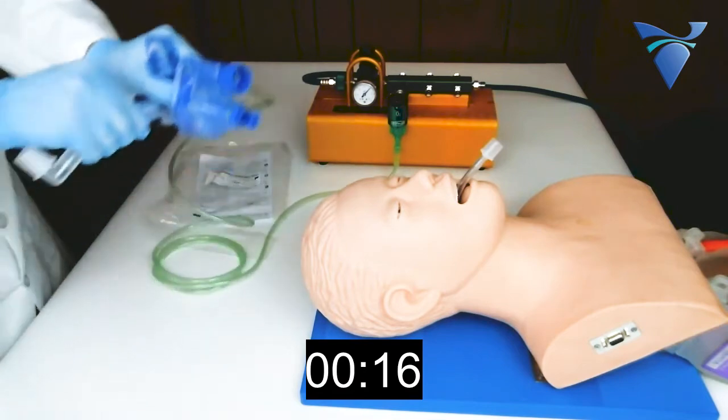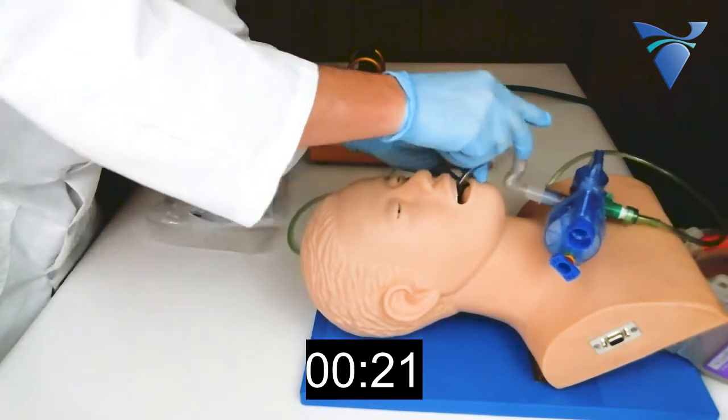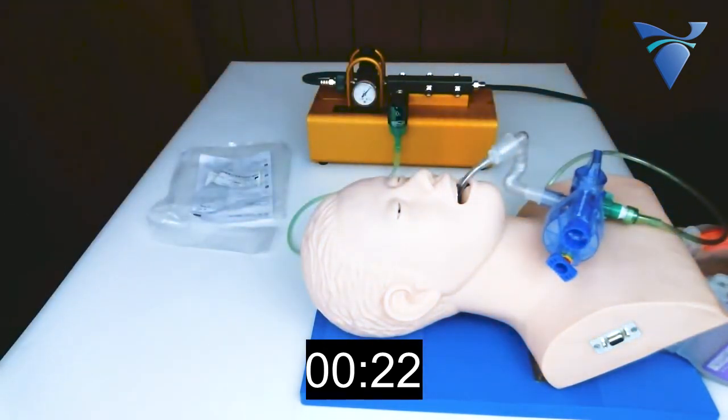The flex hose is then connected between the GoToVent and the patient's endotracheal tube. The patient is now being ventilated.